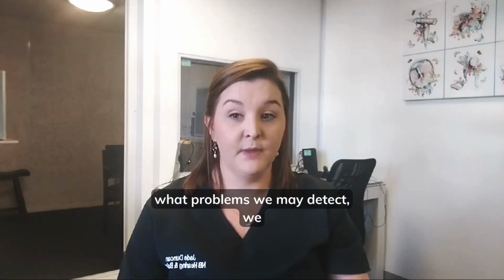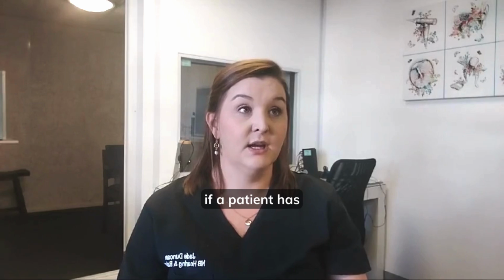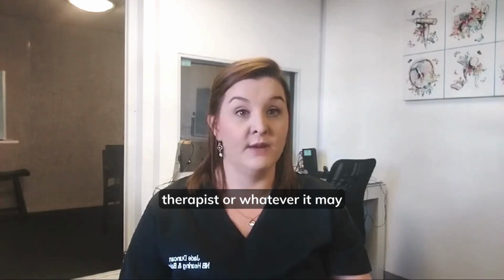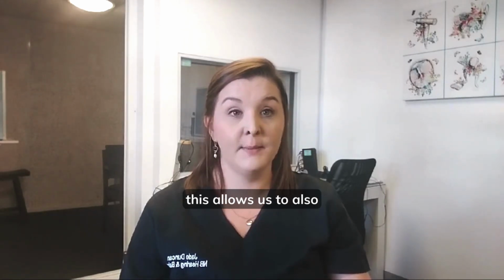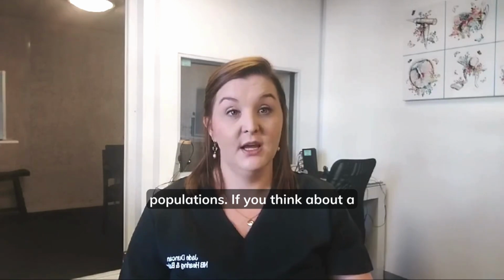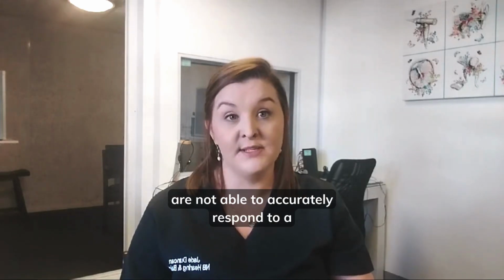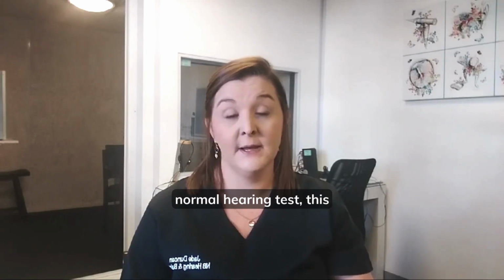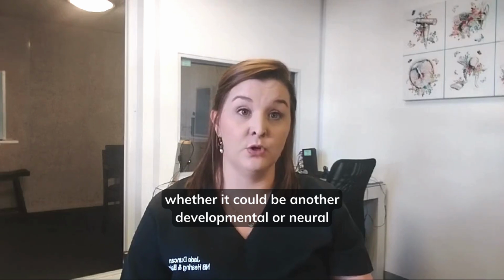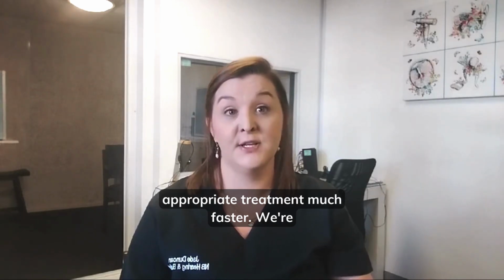Depending on what problems we may detect, we can refer to more appropriate professionals, as I said. So for example, if a patient has any other neural involvements or needs to see an occupational therapist or whatever it may be, those referrals can be made. And this allows us to also accurately help and assist our special needs populations. If you think about a child with any developmental, neurological, or physical impairment who are not able to accurately respond to a normal hearing test, this allows us to serve that population and really assess whether it's a hearing issue or whether it could be another developmental or neural difficulty that they might be experiencing. And we are then able to give them the appropriate treatment much faster.